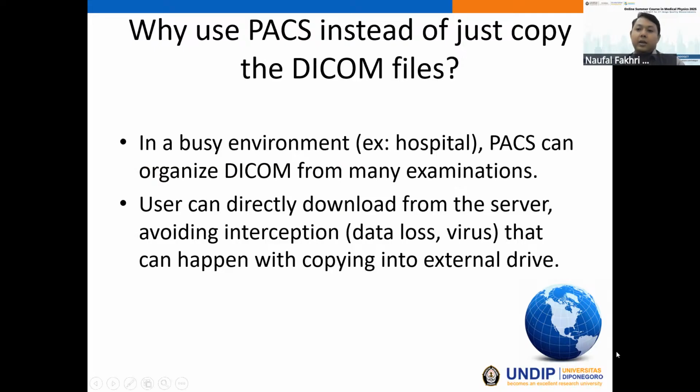So why do we use PACS instead of just copying the DICOM files after we scan an image? Basically, in a busy environment, for example a hospital or other medical facility near a hospital, PACS can organize many DICOM files from many examinations.